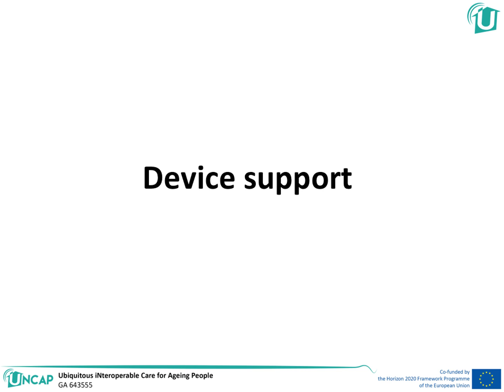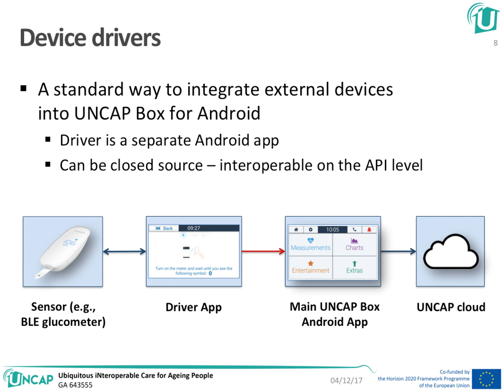Now, regarding device support, devices are an important addition for capturing medical parameters. We've defined here in Uncap a standard way to integrate external devices into the main application, and we call that a driver. A driver is a separate Android application.